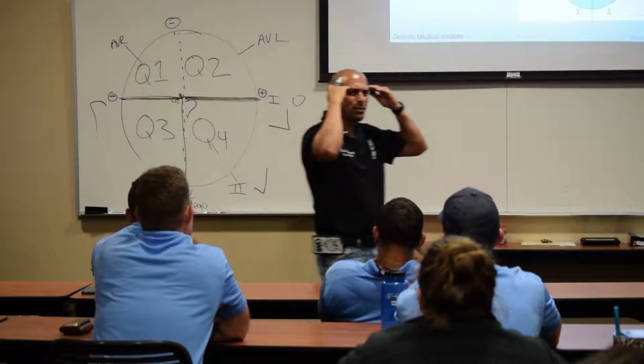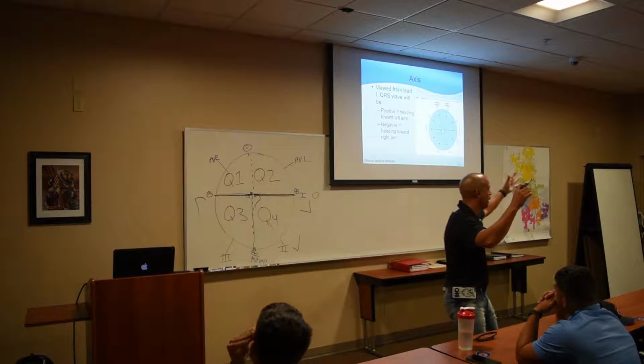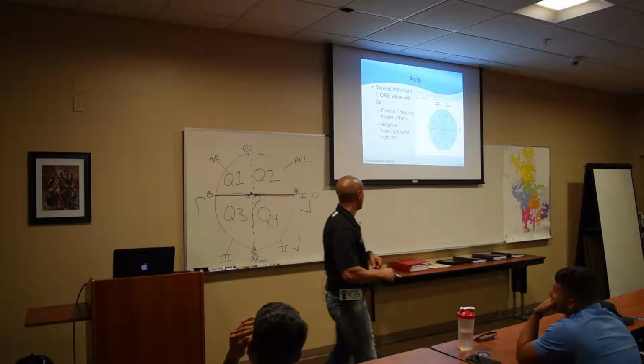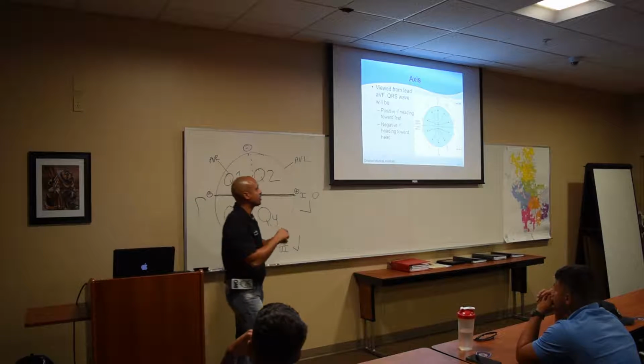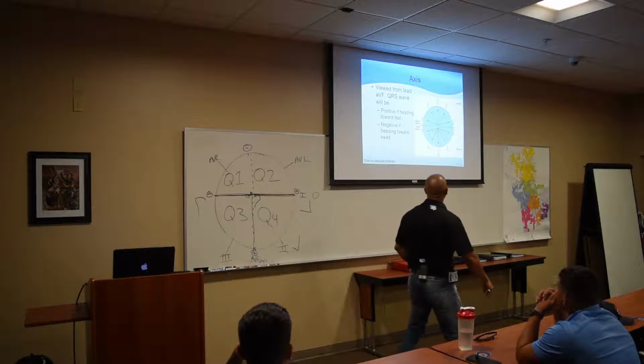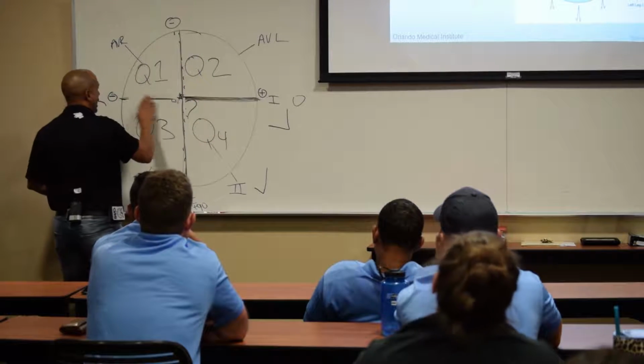You're picking up what I'm putting down. I know you say, Felix, where are you getting at? I'll get there. I just want to make pieces. I like to say my 12 leads are like a big puzzle. I'm going to give you a piece every time I speak. If you're picking up what I'm putting down, you got the big picture. So if I decided to use the other lead, AVF, that goes this way, then which way is my imaginary line?